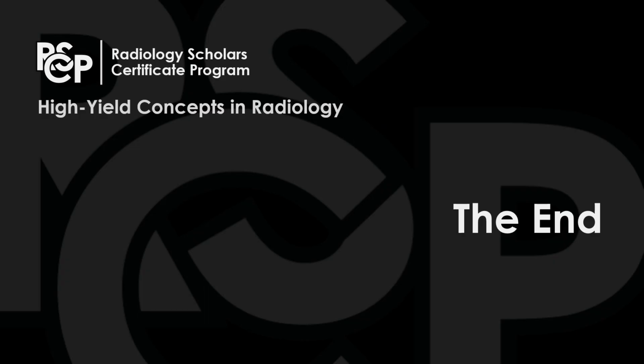So now we've come to the end of the presentation. We've walked through our two different case presentations. Our younger patient who got the ultrasound because she was below 30, our older patient who got a mammogram because she was above 30. We talked about some of the mammogram features that could be concerning for malignancy versus a benign lesion. And we talked about some of the histology of fibrocystic change of the breast, as well as fibroepithelial lesions such as fibroadenoma and a phyllodes tumor, and why it's very important to distinguish those.